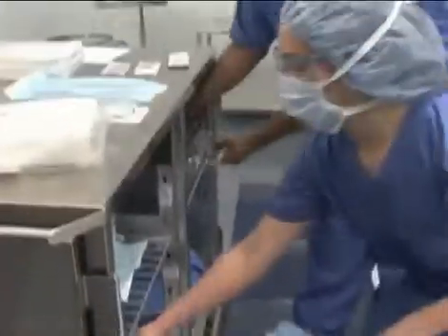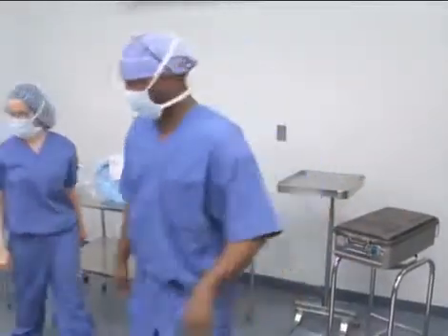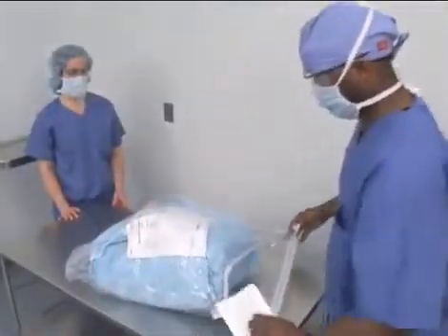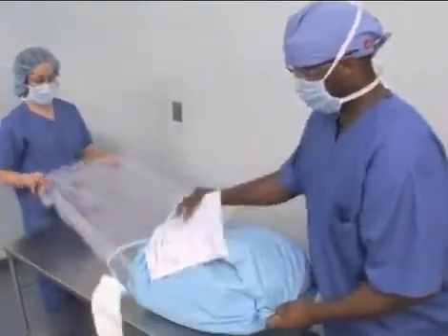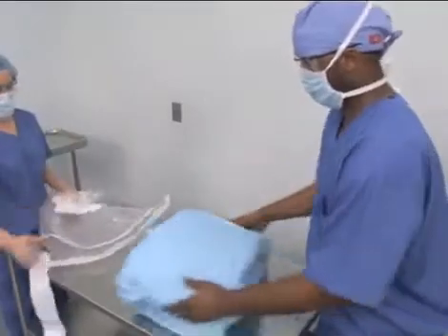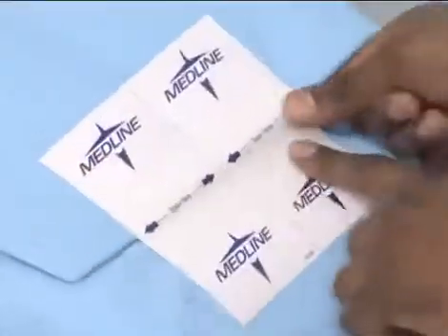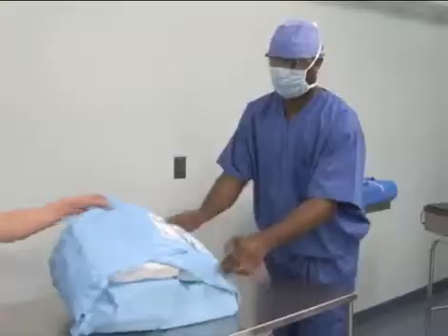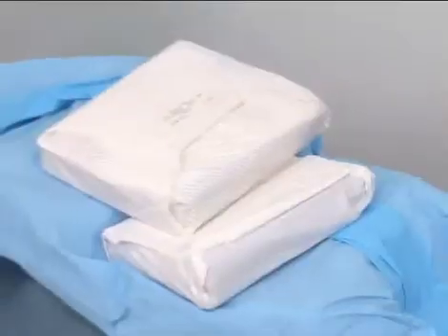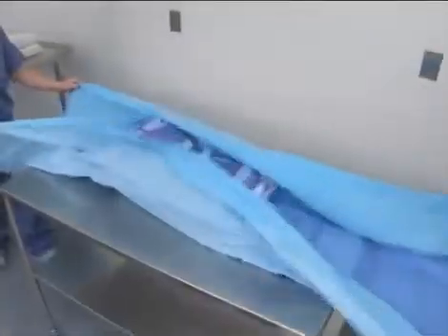Sterile supplies are opened in sequence from large to small. The basic pack, containing towels, drapes, and gowns, is centered on the back table and opened using aseptic technique. As the wrapper is unfolded, the inner sterile surface is exposed. This provides a sterile surface for other items to be distributed.